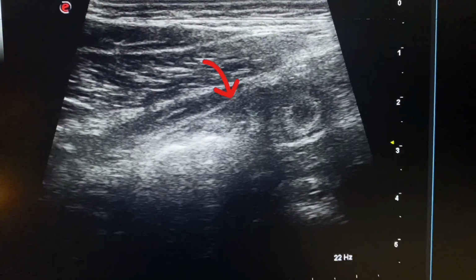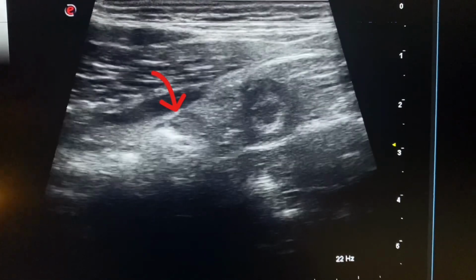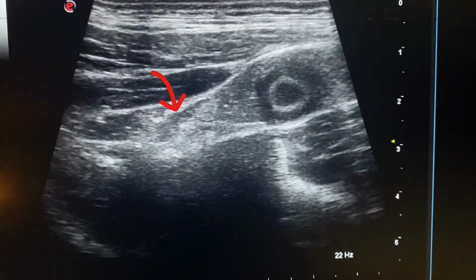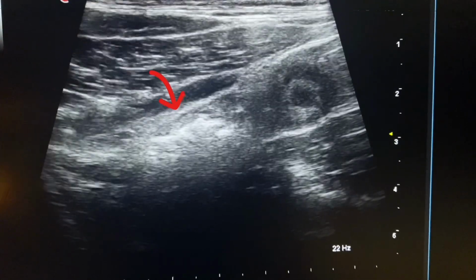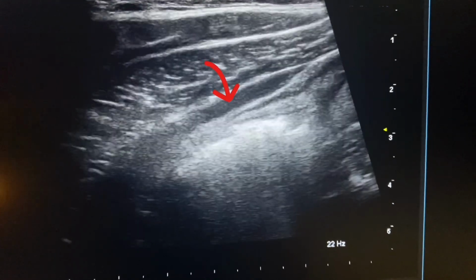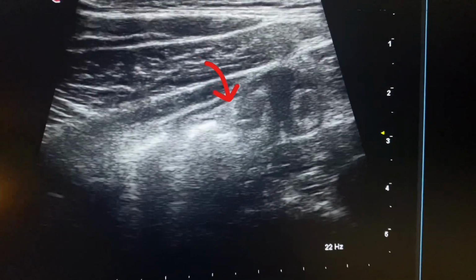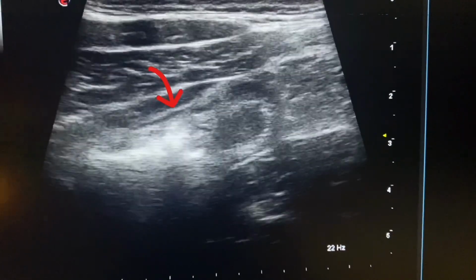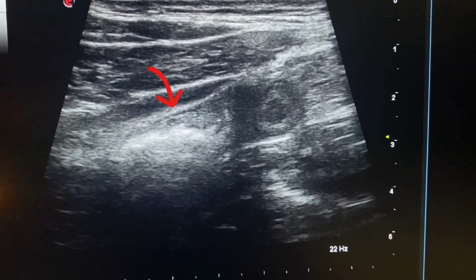In the small intestines, the gases appear as an echogenic thin line, and in the large intestine, gases are present as bubbles due to haustra. Now we will scan the cecum from right, left, and up and down to search for the appendix. We will fix the probe at this point and stop sliding, and then tilt the probe up, down, and right, left to search around the cecum.